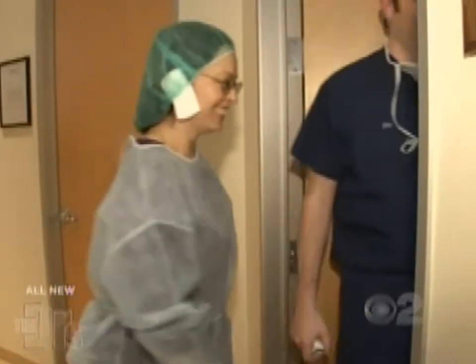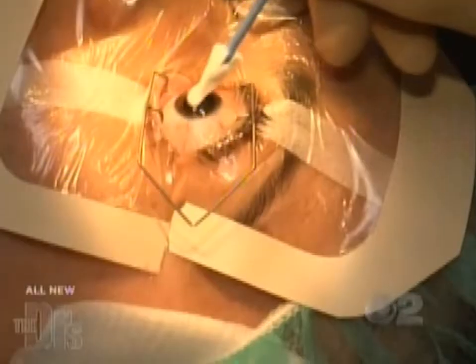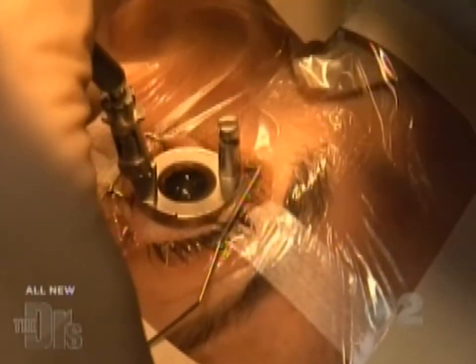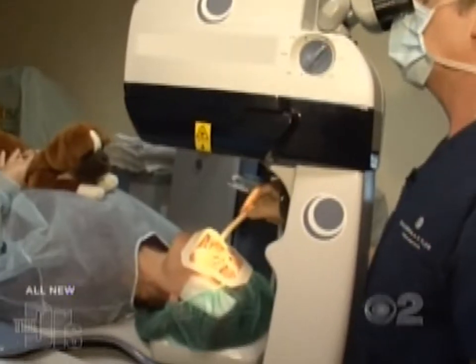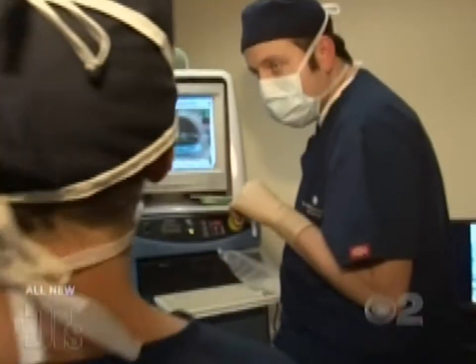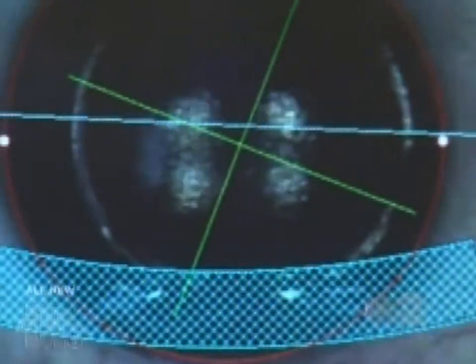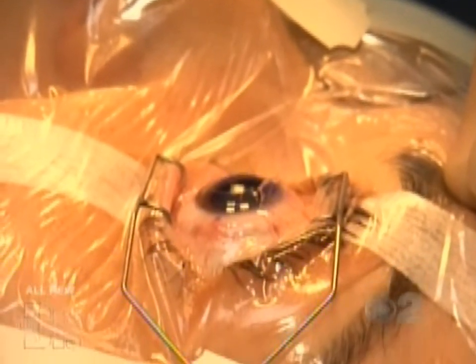Because of the way the LASIK is, we're able to compress it into basically having two procedures for one. So Sally, we're getting ready to do the advanced LASIK. This is a little mark that keeps everything lined up. It's going to give you a little squeeze now. Lights are going to go dark again. Doing just great. The cornea now is revealed. Eye tracker is engaged. We're doing the laser now — it's reshaping the cornea and everything is just flowing perfectly.